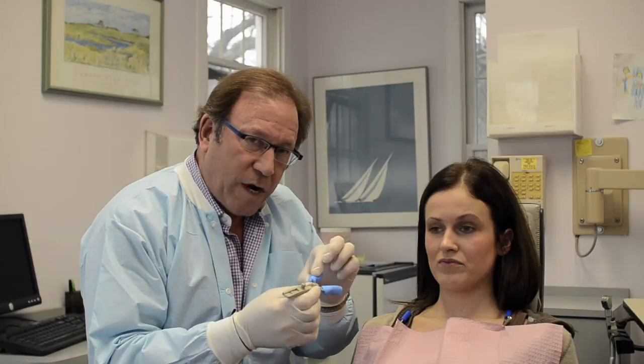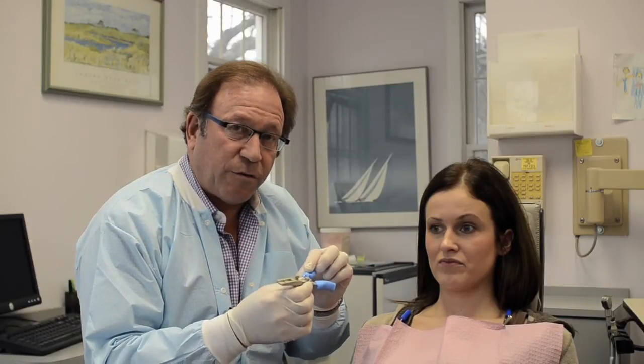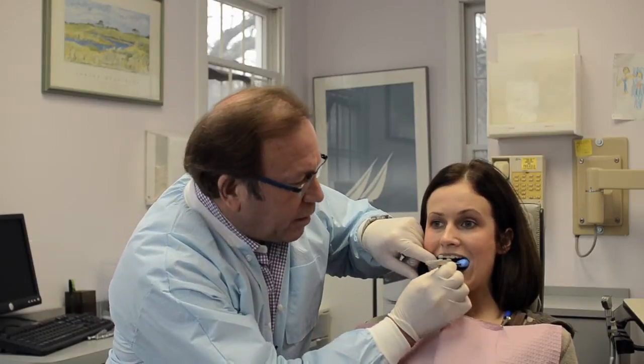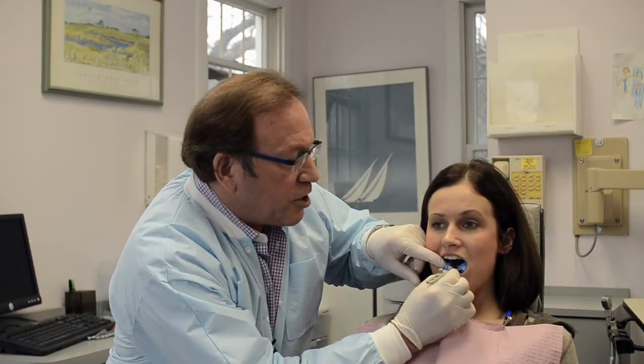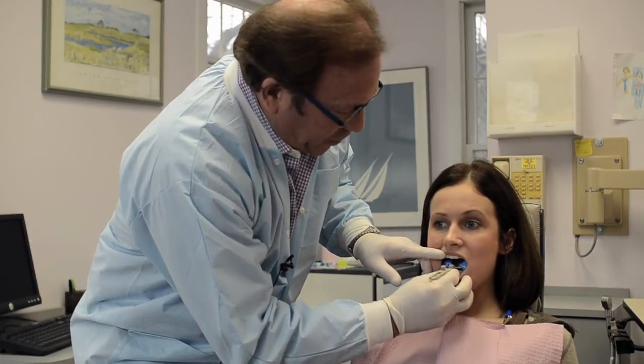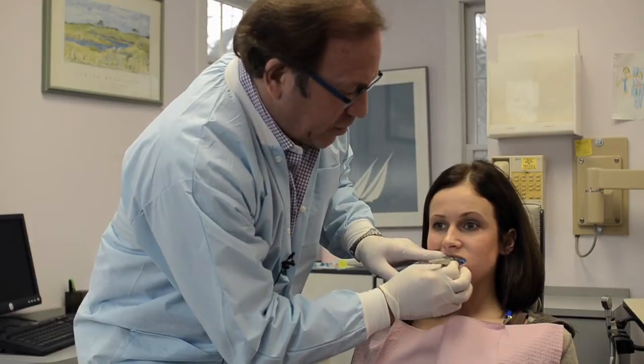After we put the warm wax that's been heated up to 140 degrees onto the bite fork, we go into the patient's mouth, and we position it so that it lines up with her skeletal midline, not the dental midline. And we ask her to close, please, bite down into the 2 notches.